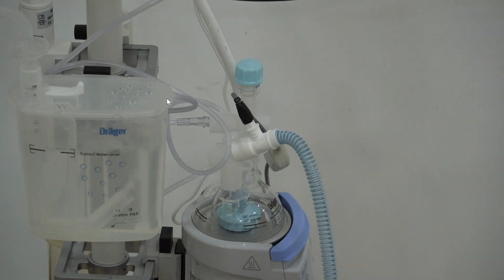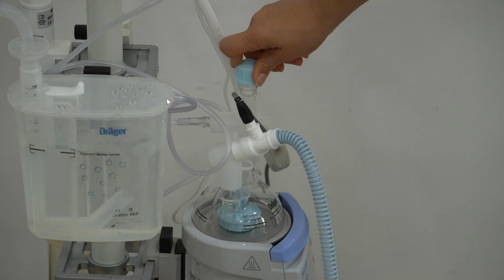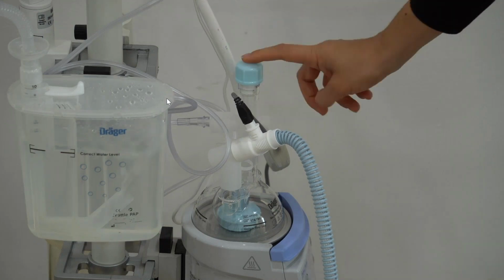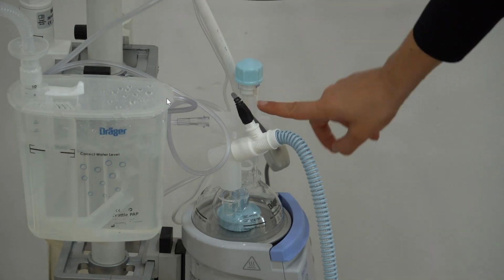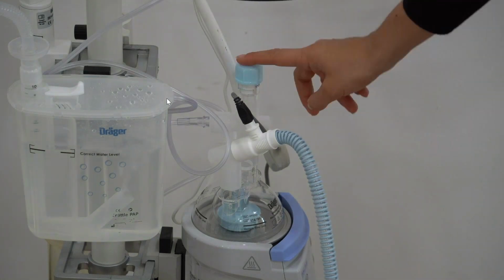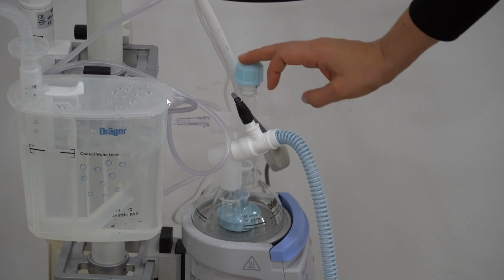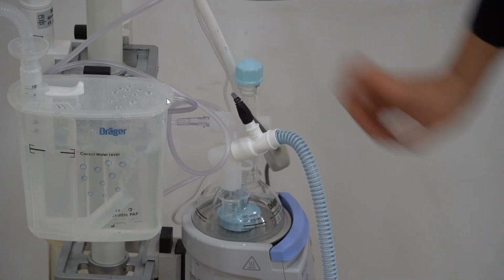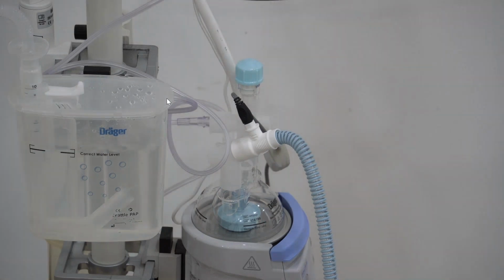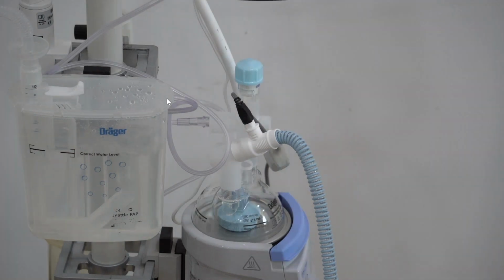In order to avoid the build-up of excessive pressures, this is the so-called safety pressure valve. Whenever we reach 17 millibar in the system, this valve will open to release the excessive pressure, in order to avoid the build-up of pressure and the delivery of excessive pressure to the baby. So this is just a safety valve to avoid excessive pressures.